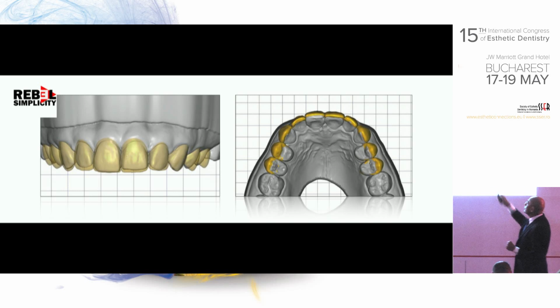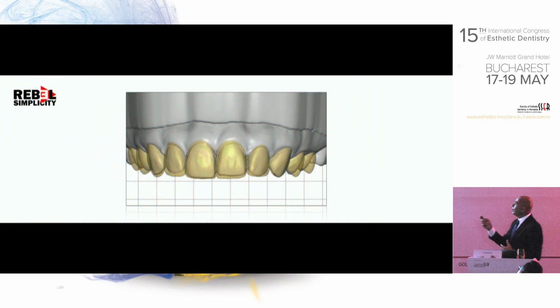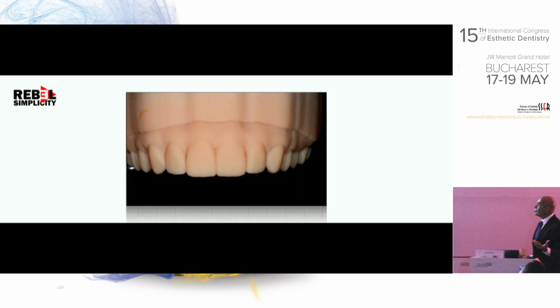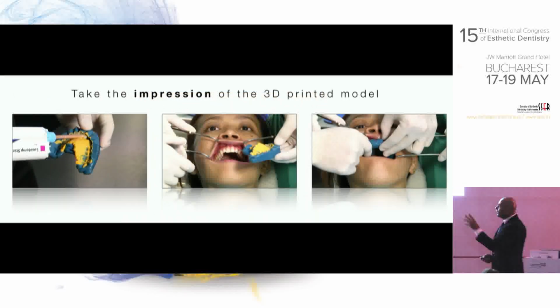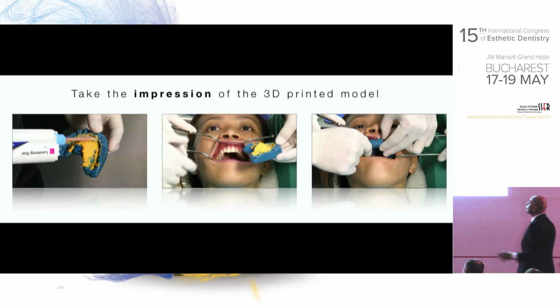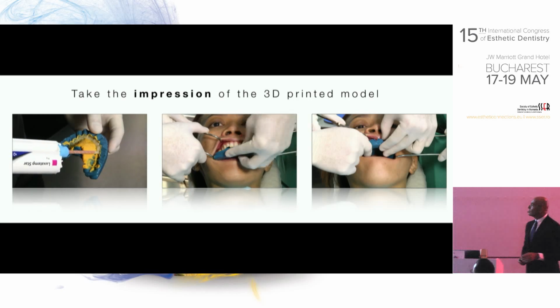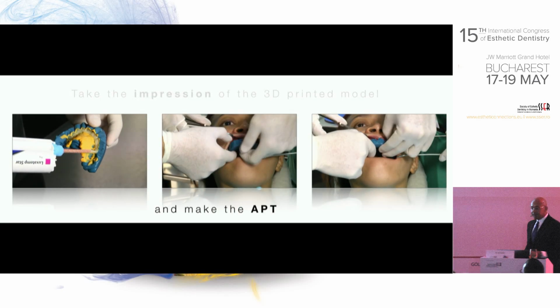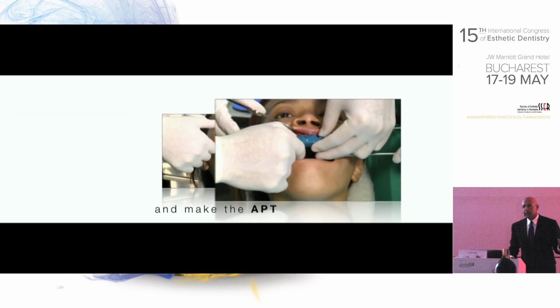With the yellow, you see the additions they made as the design. And then when it comes to you, and when you 3D print it, this is what you get. And through this, again, the same procedure, you make the impression, you load it with Luxatemp, place it into the patient's mouth, and just like a miracle, this kind of a final result will come out within a few minutes.